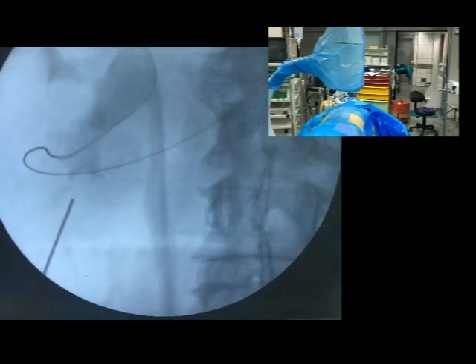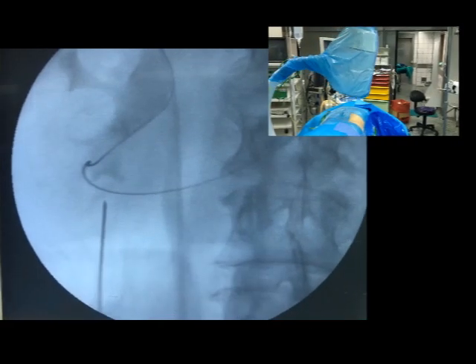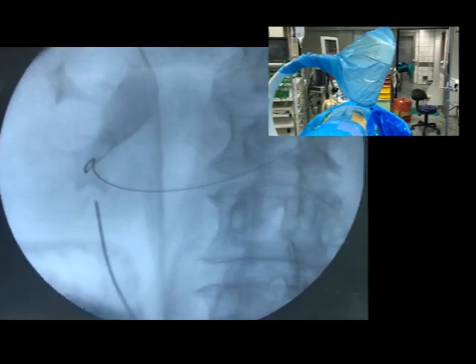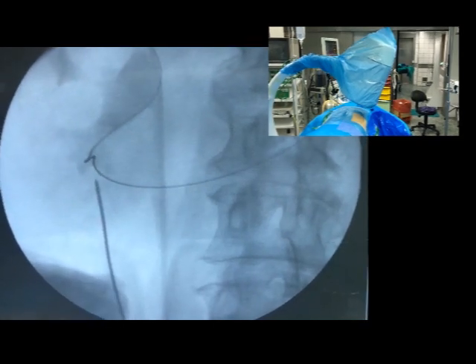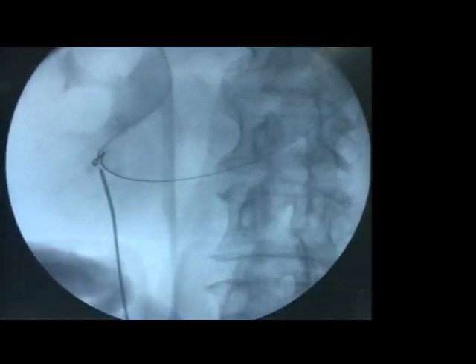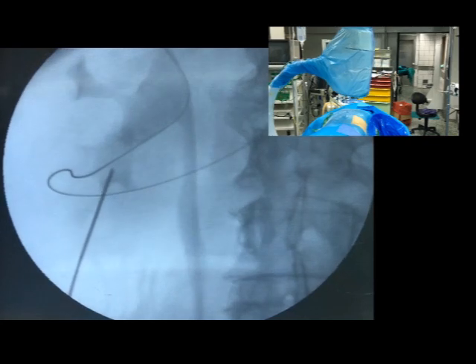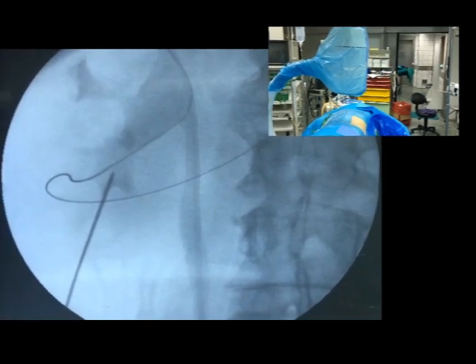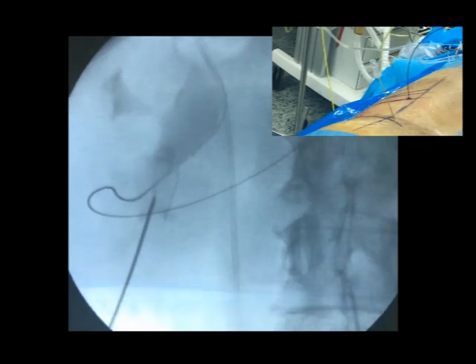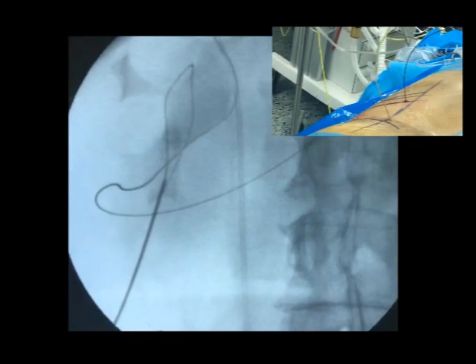After proper positioning is confirmed, the needle is advanced into the renal collecting system with the C-arm back into the oblique position. Once the target calyx has been identified with the aspiration of urine, the next step is to introduce a glide wire via the needle into the renal collecting system.